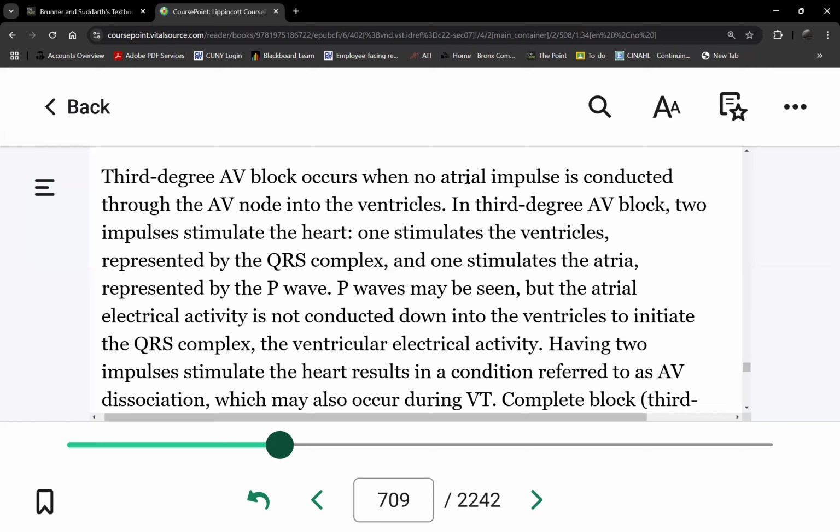We're still in the same chapter. We have not progressed yet. All right. We do have leadless pacemakers now. Leadless are this size. That's the actual size of a pacemaker. It's implanted in your ventricle. It's leadless, so will you see a big machine? You won't even see it because it's inside the patient's heart. It's very small and it has a battery inside, and it lasts for 10 years. So these are modern leadless pacemakers.